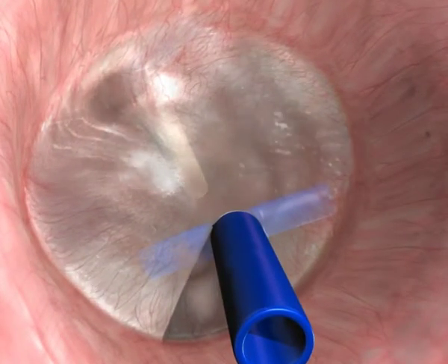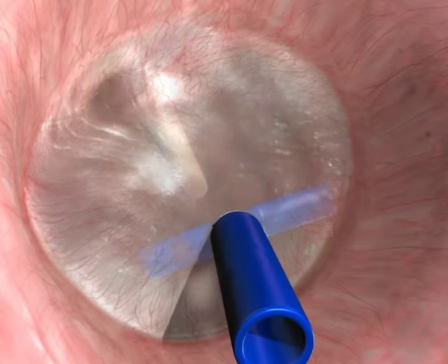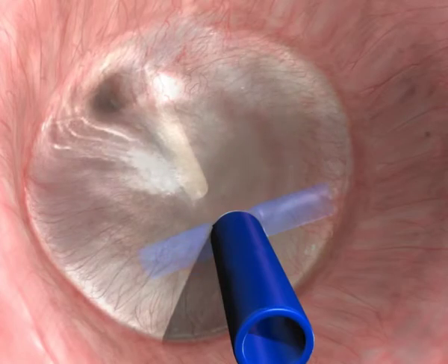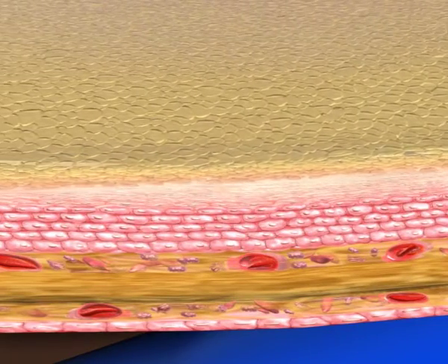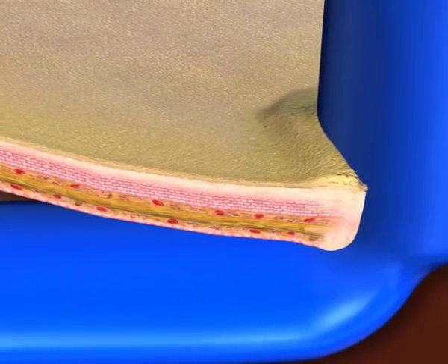The relationship between the tube and the eardrum is affected by the natural migration of the epithelium from the germination area near the umbo to the periphery. The epithelium accumulates on the tube, pushing it and tilting it posteriorly.